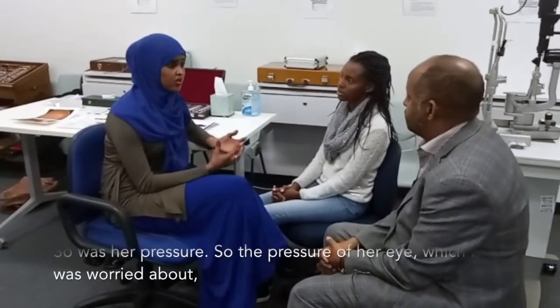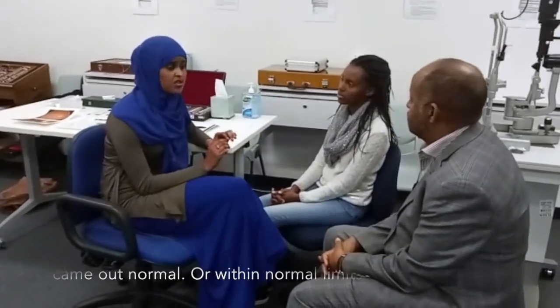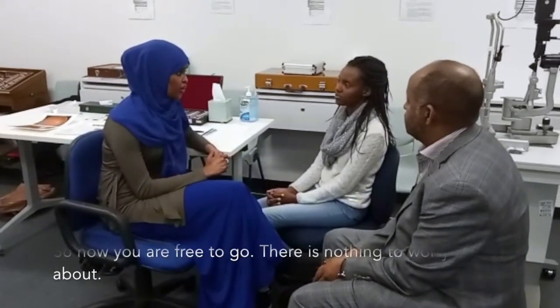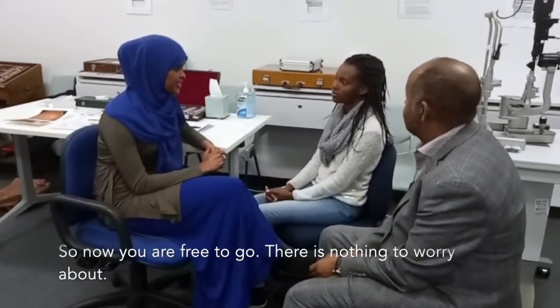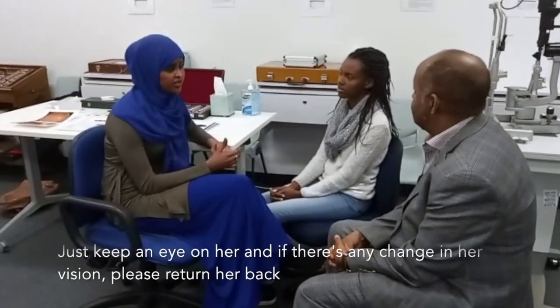I've done all the tests. The results came out normal. So as her pressure. So the pressure of the eye, which I was worried about, came out normal, within the normal limit. So now you are free to go. There's nothing to worry about. Just keep an eye on her, and if there's any change in her vision, please return her back.